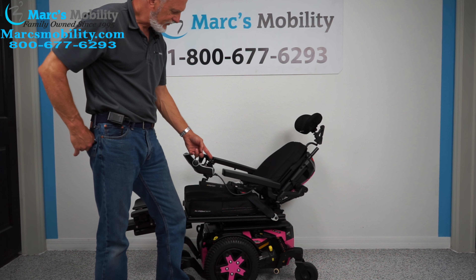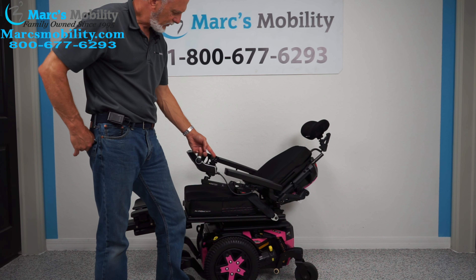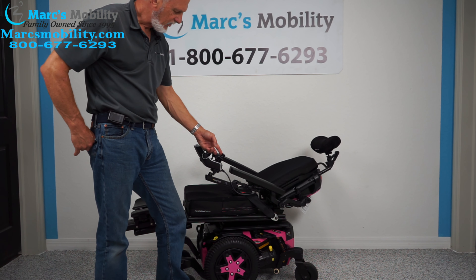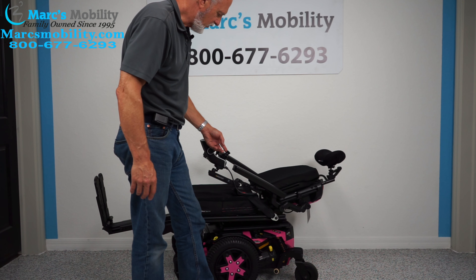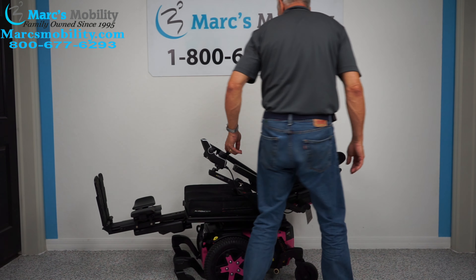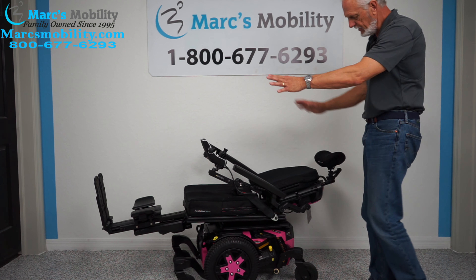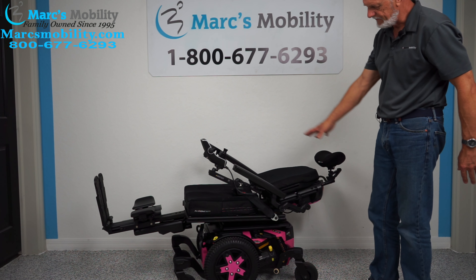So this chair has electric tilt, electric recline, and electric feet with 12 miles. It's a gorgeous power chair. If you're laying flat, this is what it would look like — this is as far as it'll go, your laying flat position.